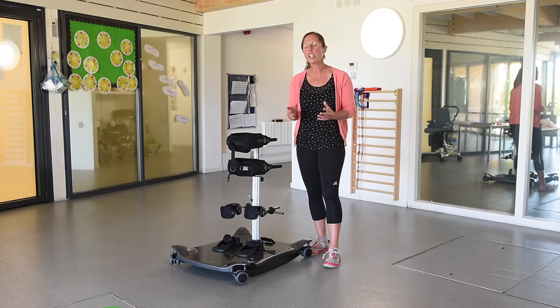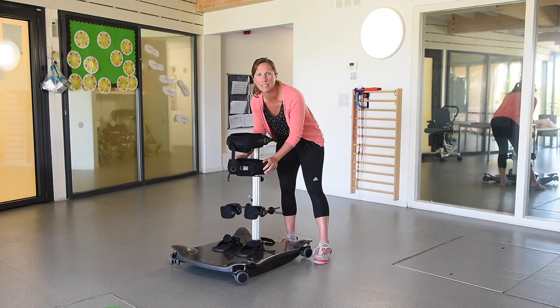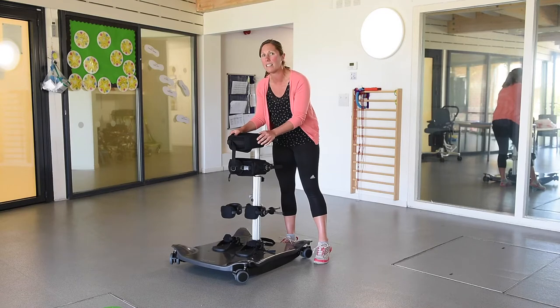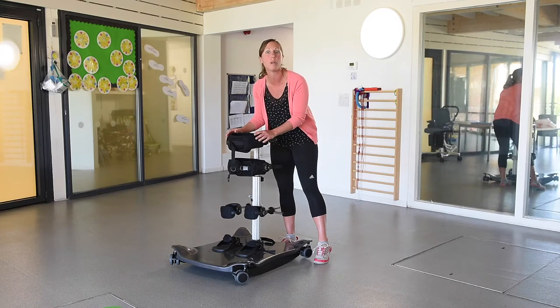Starting out, you're looking at finding the points of instability in that child and setting these supports up to where you need them to be. One of the best things about this is the fact that you can easily get that body alignment, which is crucial when you're looking at challenging that posture control from the point of instability.